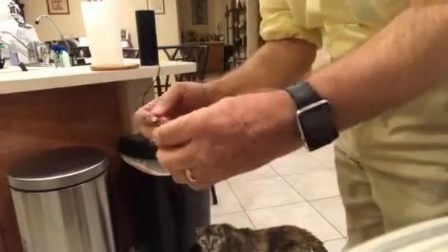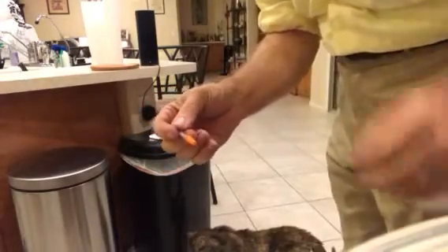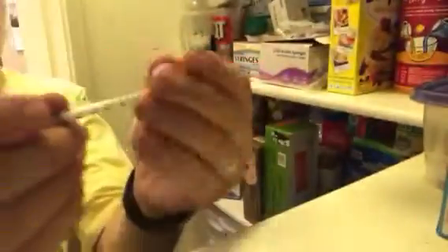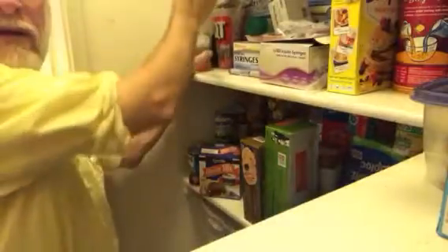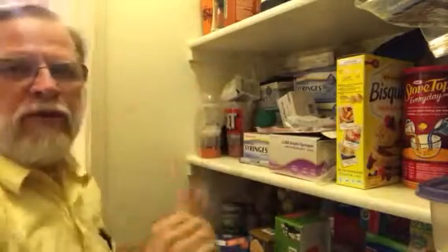Then we can come and put the cap back on and put that in the cup in the cabinet again. Just put that back in the cup over here. And there we go.